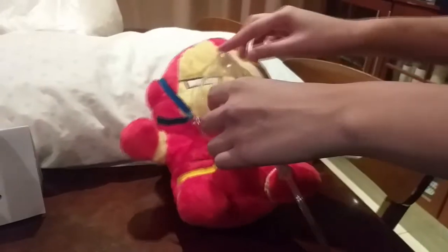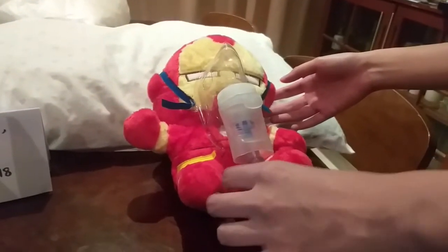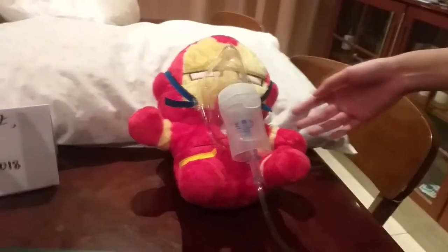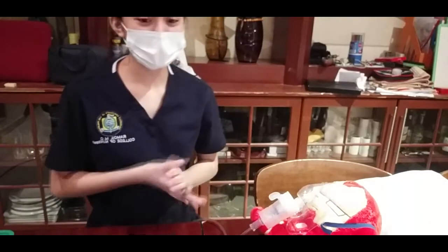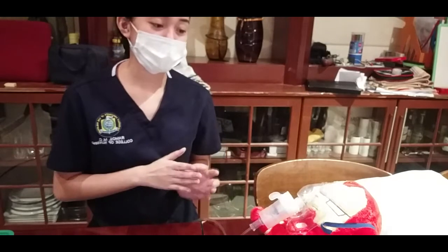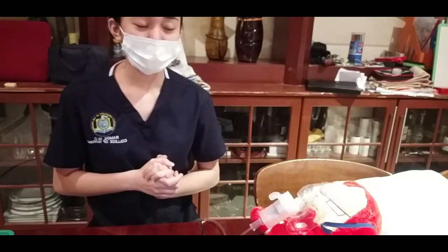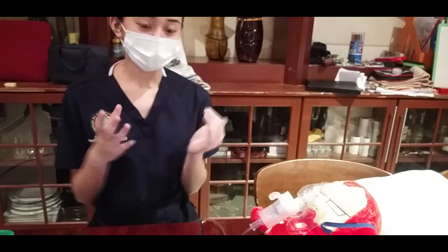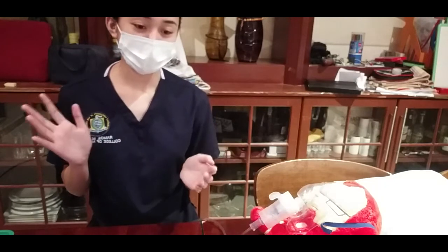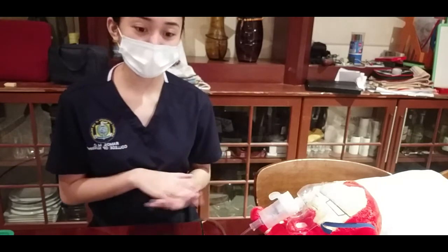Next is I will be assessing the patient's breathing and adjusting the equipment if necessary to ensure delivery of prescribed oxygen therapy in conjunction with the specific cannula or mask. Next, I will be explaining the safety precautions to the patient and watchers, that smoking or any spark or smoke is prohibited because the oxygen is on. And I will also be explaining it to the family as well to increase compliance and cooperation.